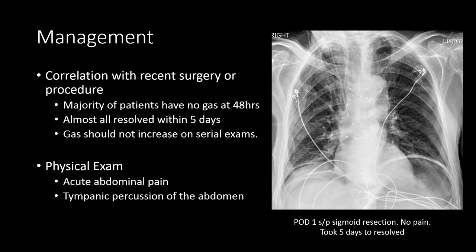Here we can see a patient with free intraperitoneal gas under the diaphragms. You can see gas here and a large volume of gas under the left hemidiaphragm with a separate gastric bubble. This is a patient who is post-op day one from a sigmoid resection. They did not have any abdominal pain, and this large amount of gas took approximately five days to resolve and was followed with serial radiographs.